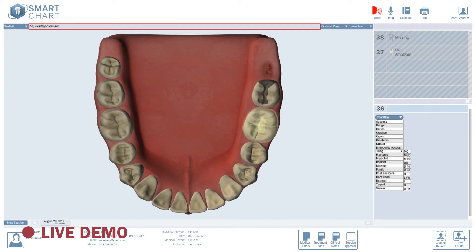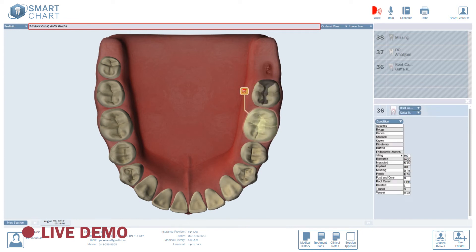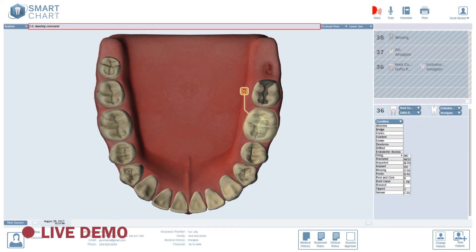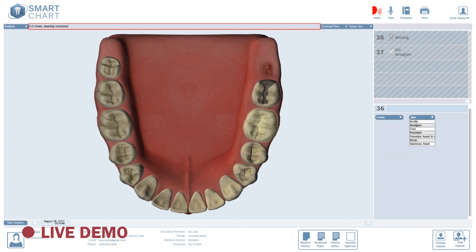3. 6. Root canal. Gutta perca. Endodontic access. Amalgam. Got it all wrong? No problem. Clear. Crown. Gold. Thank you.